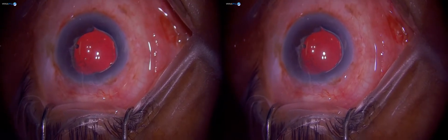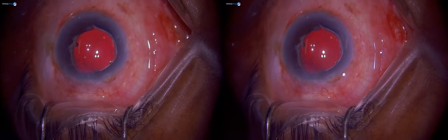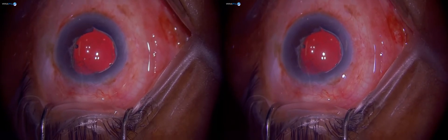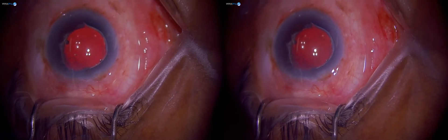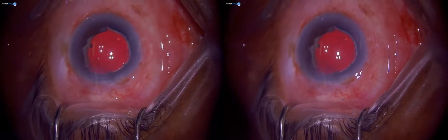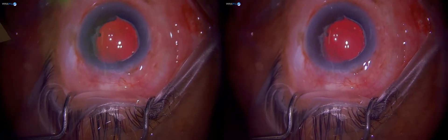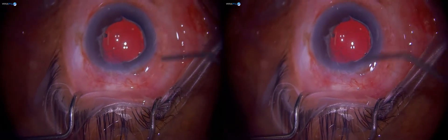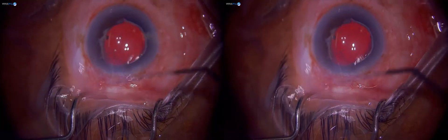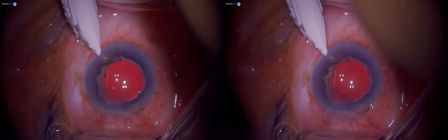This patient has diabetic retinopathy. In the other eye there was a tractional detachment of some sort with a membrane, but it was stable. This eye has a sub-hyaloid hemorrhage on the macula with diabetic retinopathy changes. The plan is to remove the vitreous, approach the sub-hyaloid hemorrhage, clear the blood, and then do a 360-degree laser PRP to regress the retinopathy. We'll see if anything else is required during surgery.